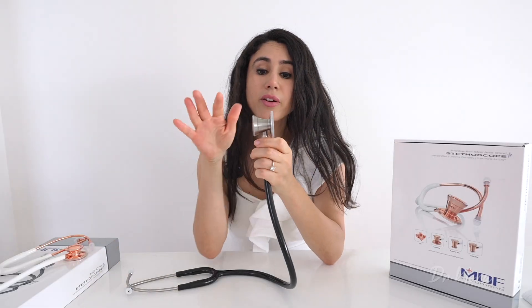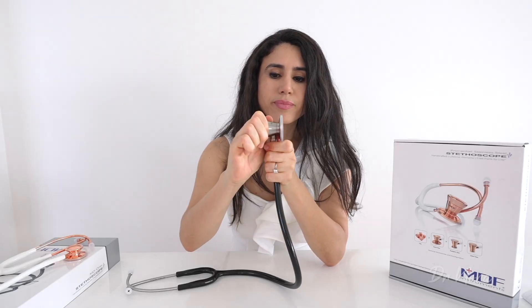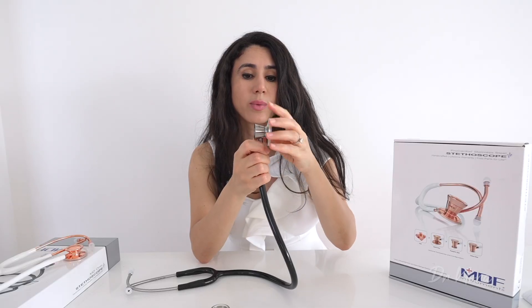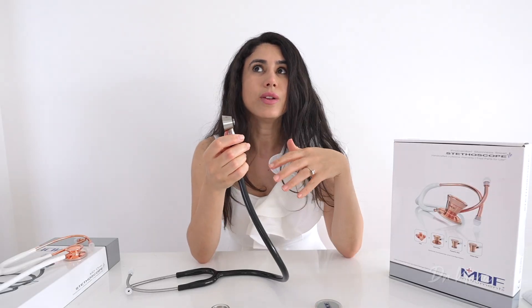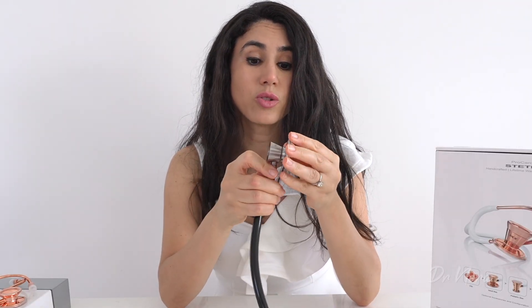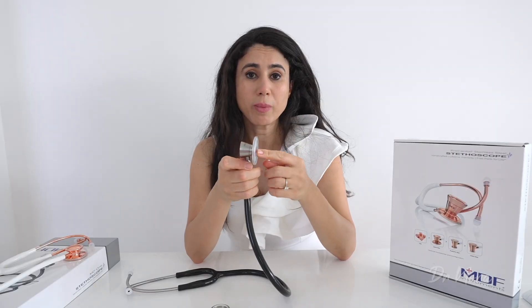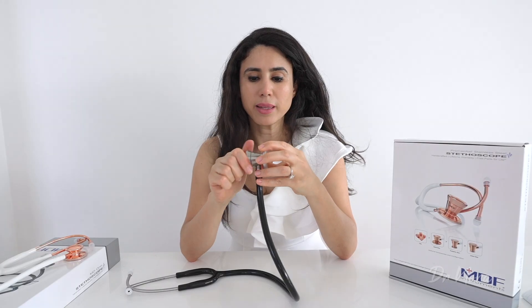The chest piece is currently affixed with the adult chest piece, and you can actually unscrew it — if your stethoscope comes with it, it does include a pediatric chest piece as well. So if you're a general practitioner or cardiologist needing to listen to a pediatric heart, you can just switch it over. Although practically, I'm not sure I'd carry different chest pieces in my bag as I might end up losing them.